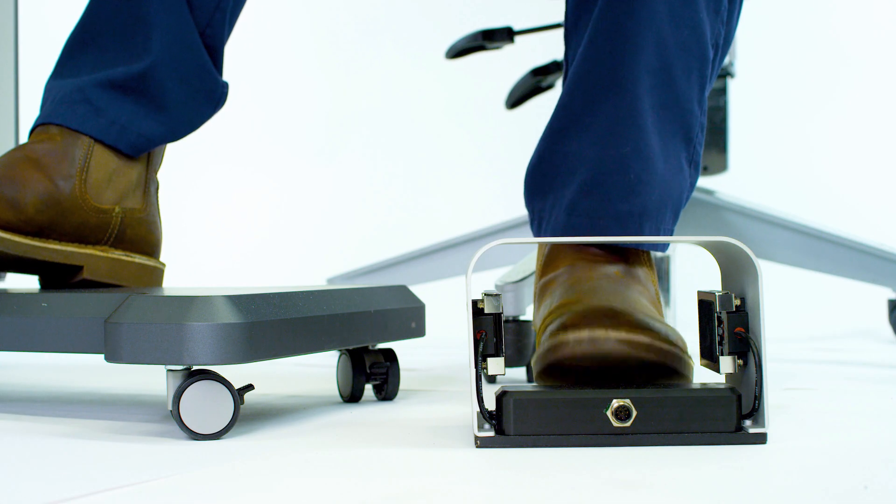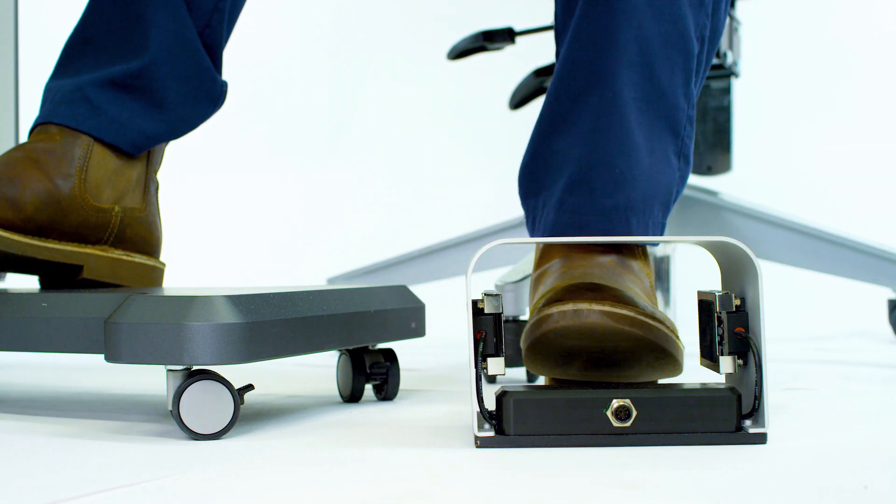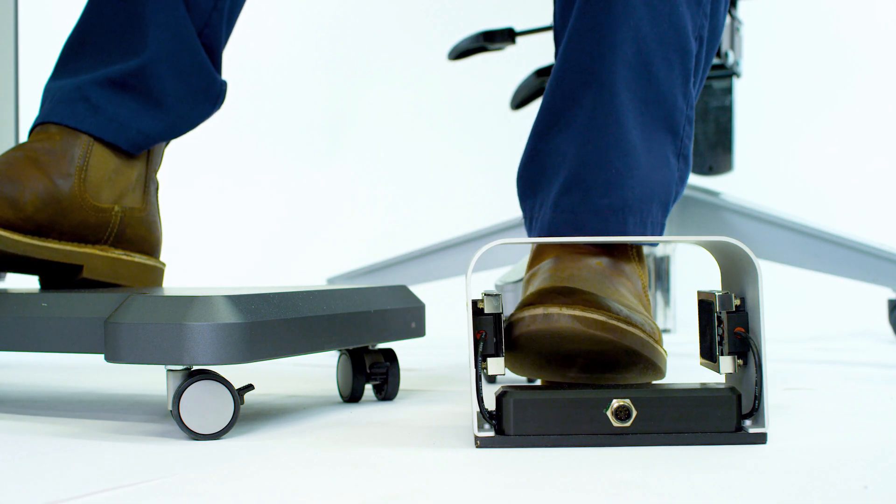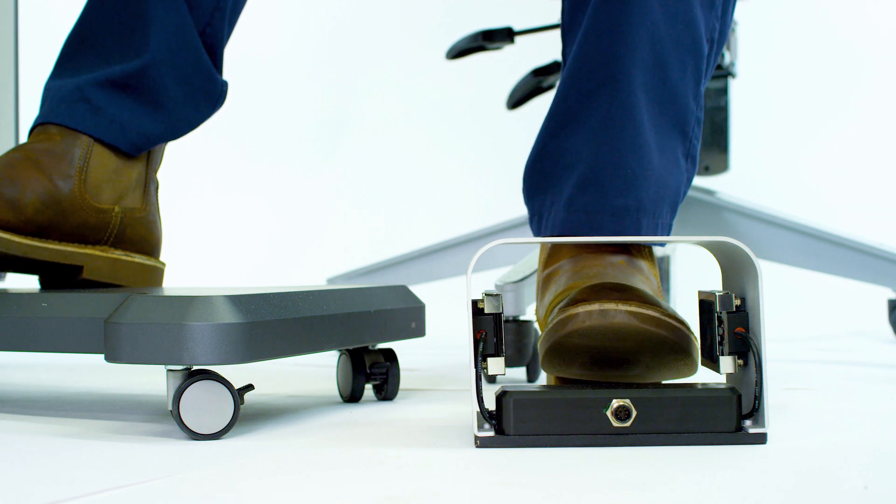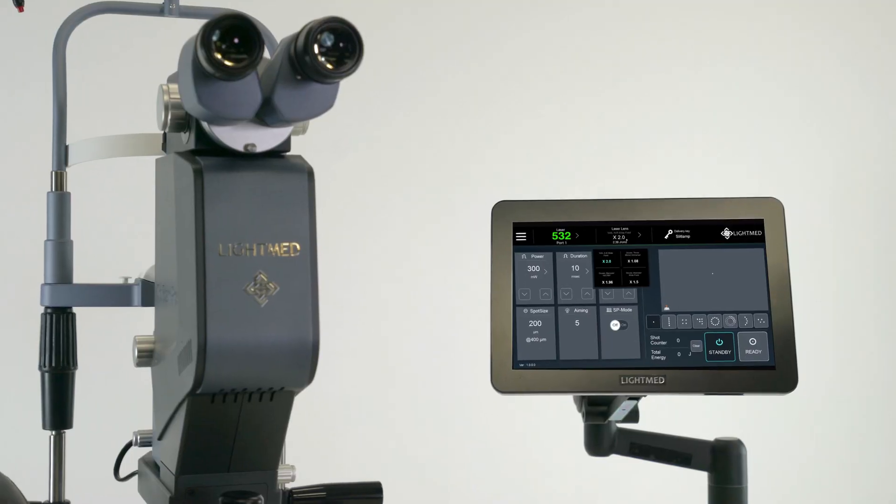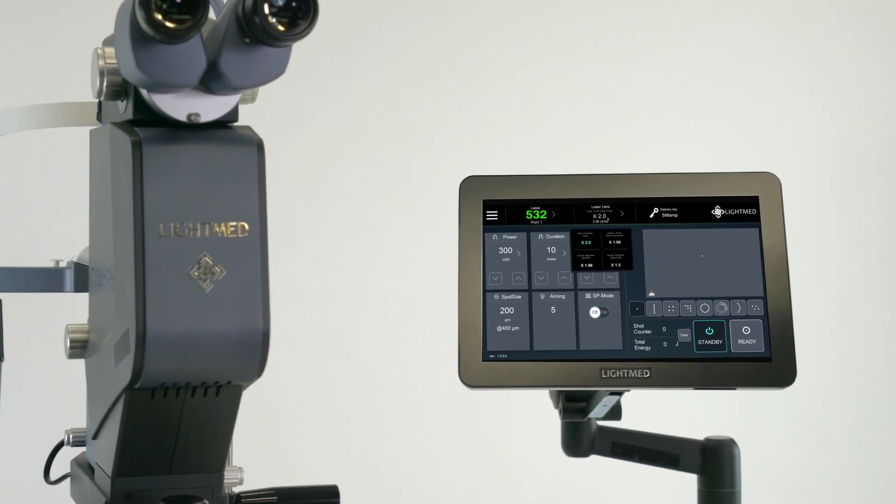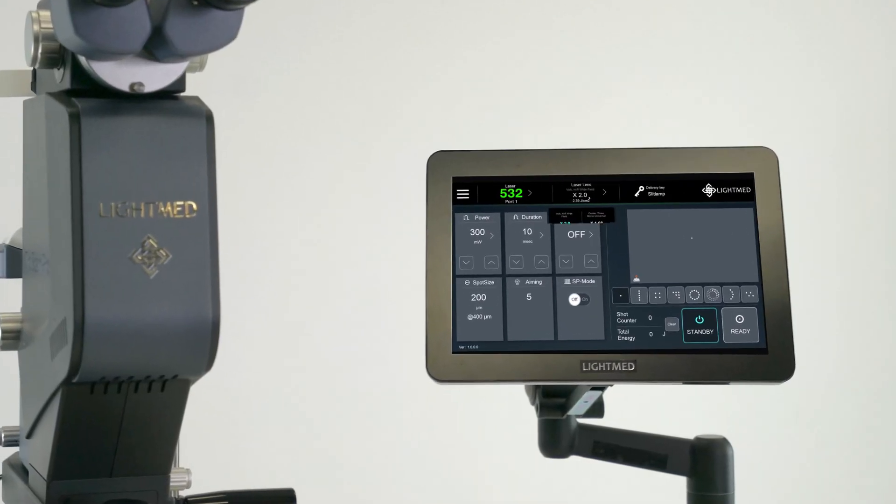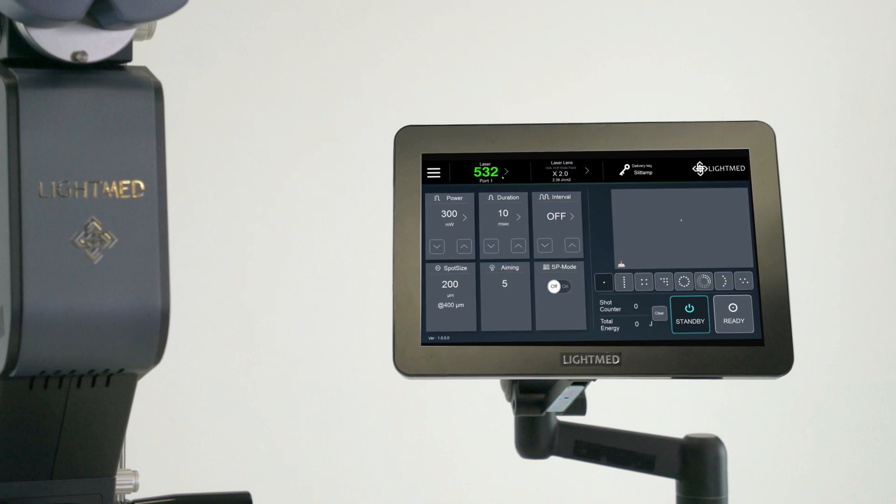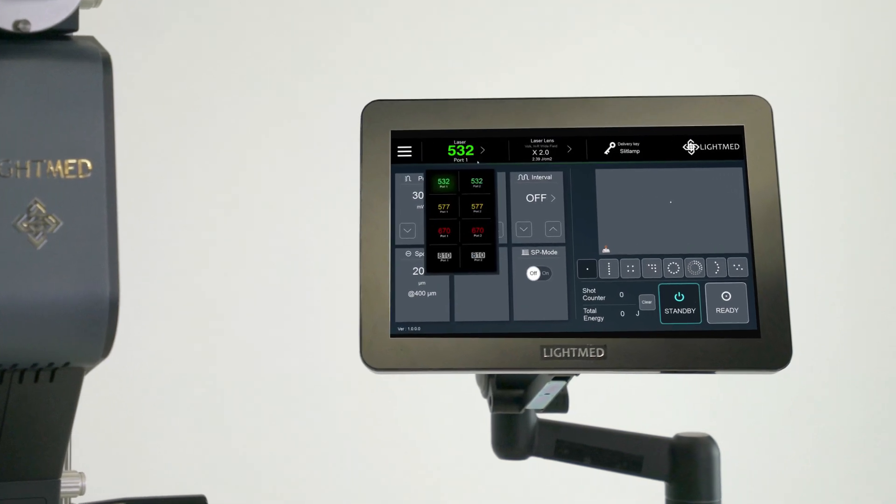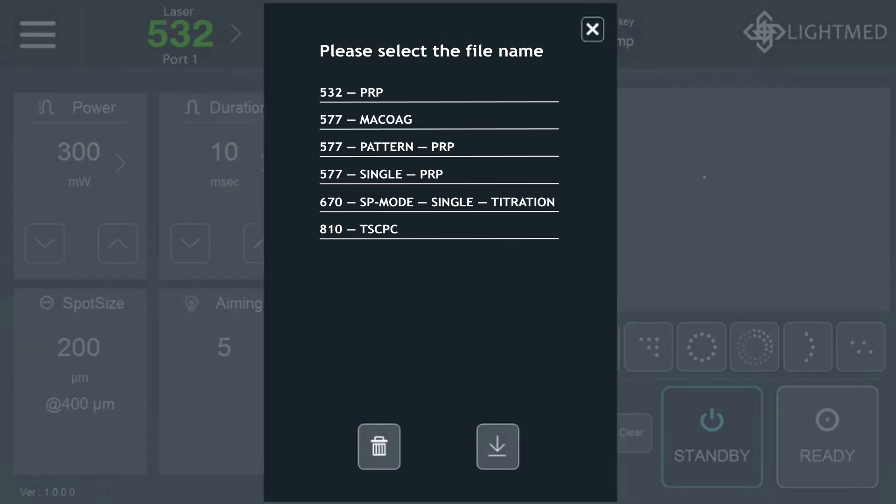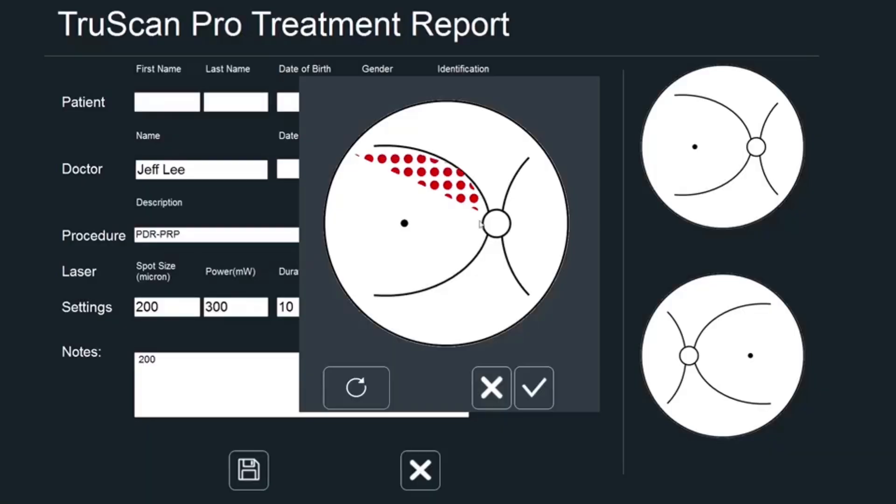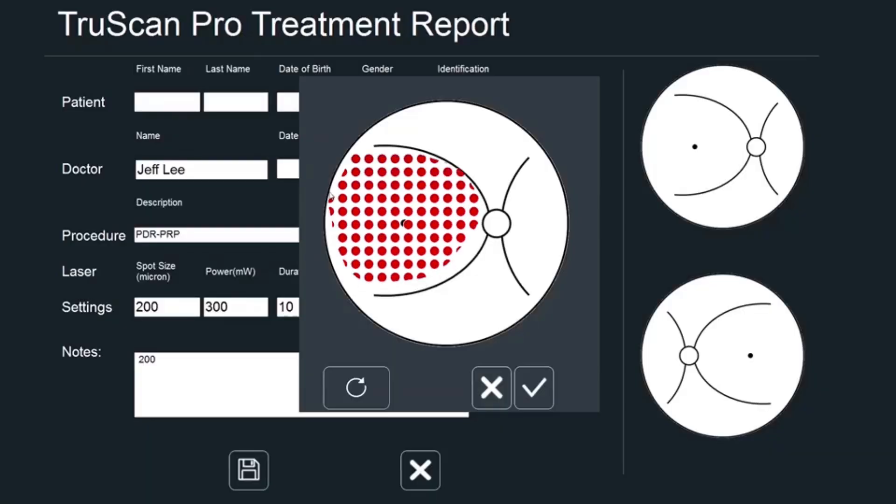A simple tap enables adjustment of treatment power settings quickly and easily. The advanced LCD touchscreen includes an intuitive graphic user interface that offers built-in treatment parameters and storage capability with patient reporting for the user's convenience.